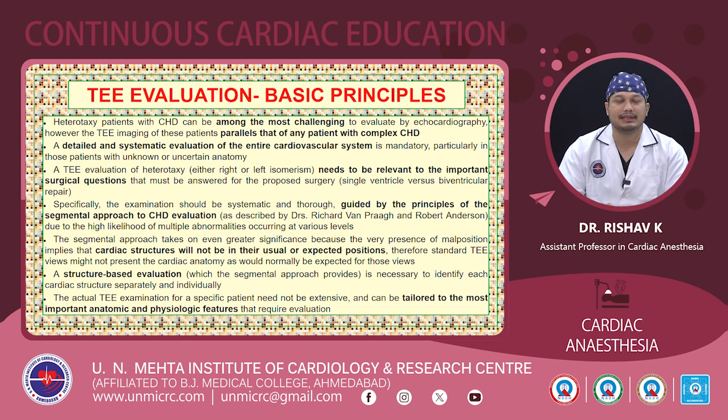So heterotaxy patients, as I have already discussed, with congenital heart disease can be among the most challenging to evaluate by echocardiography. However, the TE imaging parallels any patient with complex CHD. So we need to perform a detailed and systemic evaluation of the entire cardiovascular system, particularly in those patients with unknown or uncertain anatomy. And the TE evaluation of heterotaxy is quite complicated, but it needs to be relevant to the important surgical questions that must be answered to the proposed surgery.